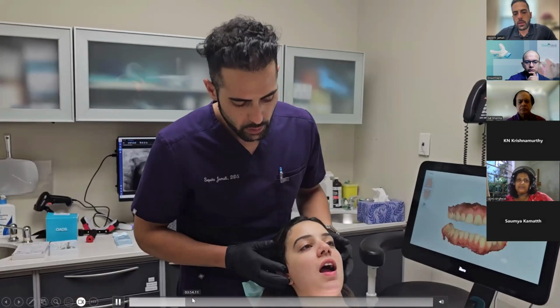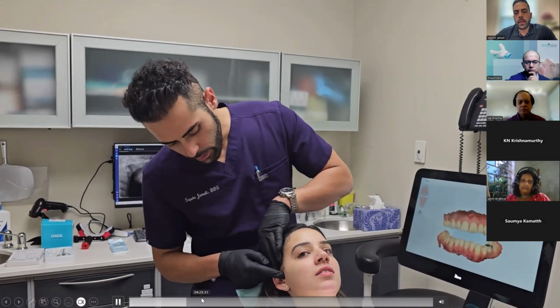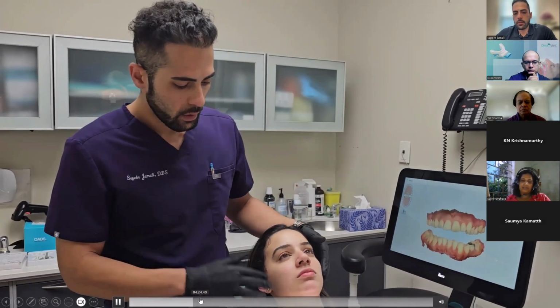So after that, we start asking the patient to clench all their teeth together. And then we start palpating all the muscles of mastication, starting from the masseter and temporalis.